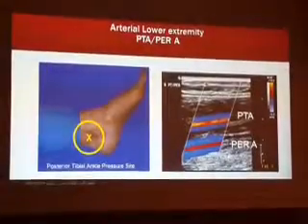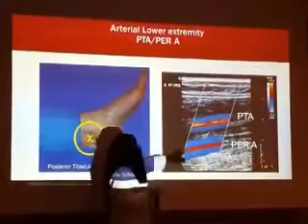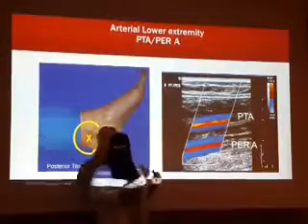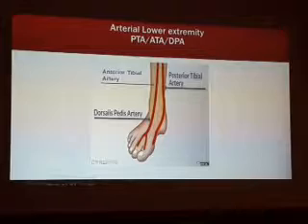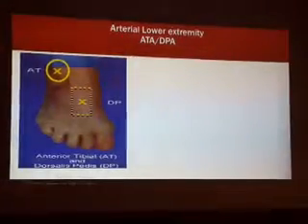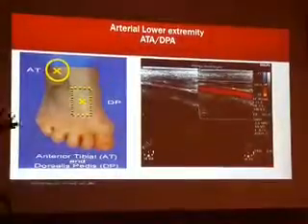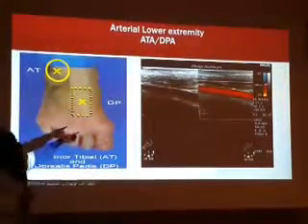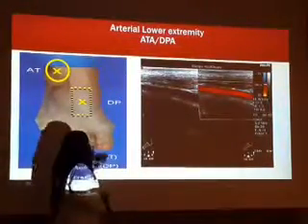This image you will see if you sample it distally, you will find it straight away. Just open your box and you will find the deeper one is the peroneal and the superficial one is the posterior tibial. Just know your axis. Know your axis very well, it will be easy. Now the anterior tibial will be in the anterior leg, and close to the bone. Very superficial, close to the bone, because it is anterior.